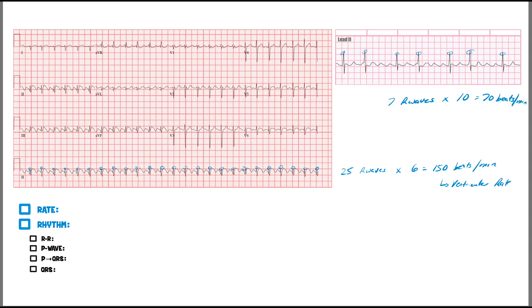We have 150 beats per minute on the main strip. Confirming with the box method: there's about two boxes between R waves — 300 divided by 2 is 150 bpm. Looking at the R-to-R interval, it's about two boxes consistently throughout: one-two, one-two, one-two. The R waves are falling right on the box lines. This is definitely a regular rhythm.